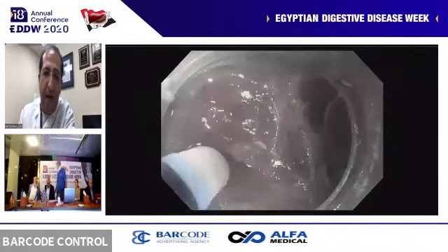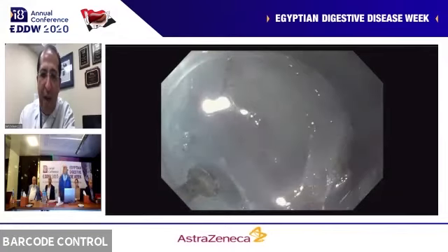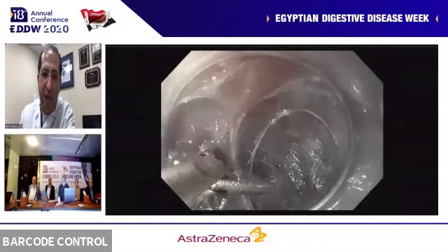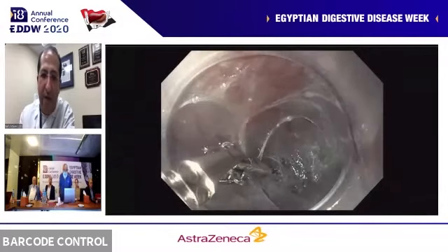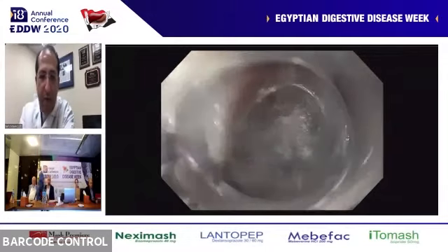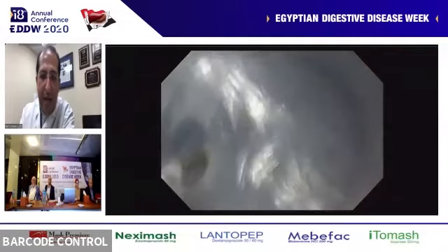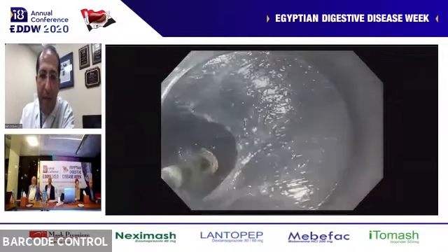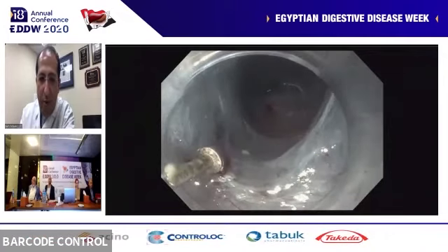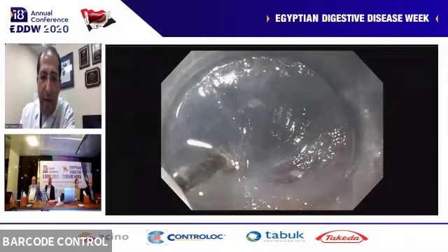I'm very careful not to break into vessels. I inject away from it to create a space and a cushion. I coagulate very gently. I use the coag grasper with these big vessels perforating from the muscle at 6 o'clock all the way to the mucosa at 12 o'clock. I make sure that the vessel is completely coagulated. Again, I'm dissecting. I'm going a millimeter at a time. Anything that's bleeding or oozing, I coagulate. I do not ignore. Again, I'm moving forward.